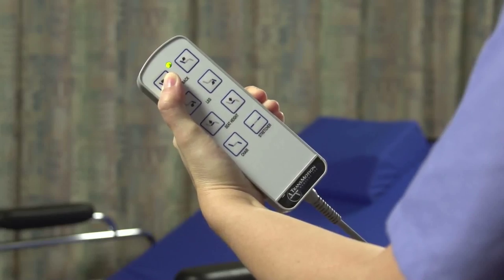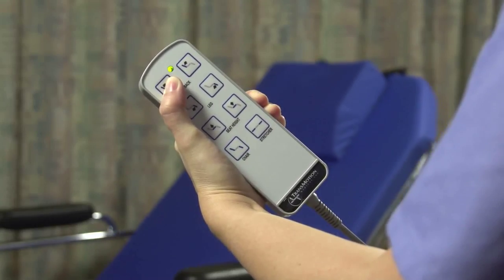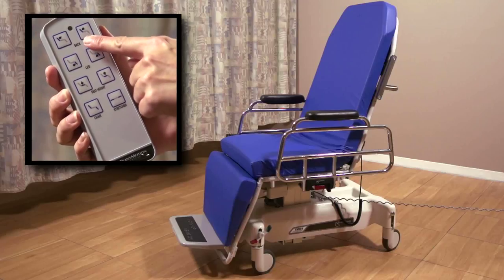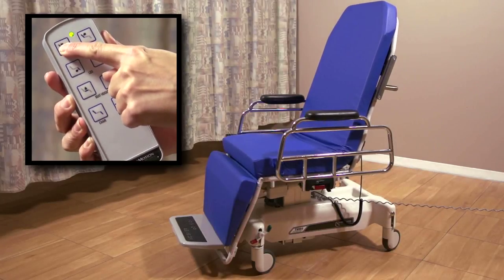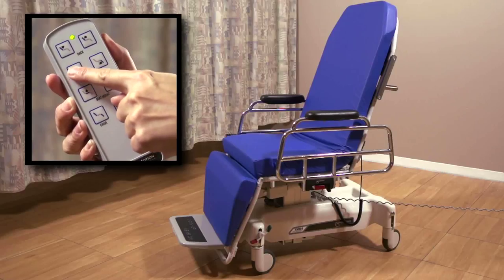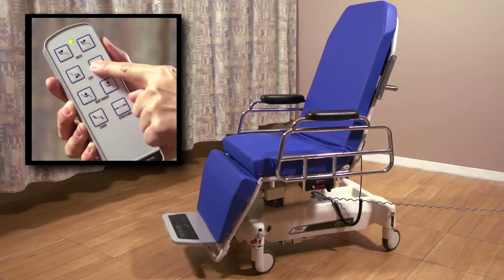The hallmark of every TransMotion Medical stretcher chair is its exceptional motorized patient positioning. Using the handheld pendant, you can take your patient from supine to upright and everywhere in between. The top two buttons adjust the back — the right button lowers it and the left button raises it. The second row of buttons controls the leg adjustment: the left button raises the leg section and the right button lowers it.